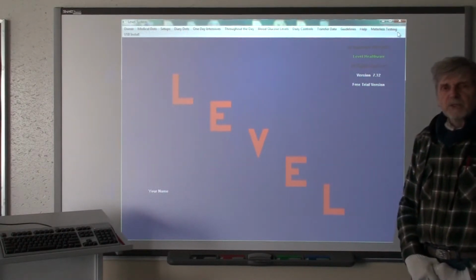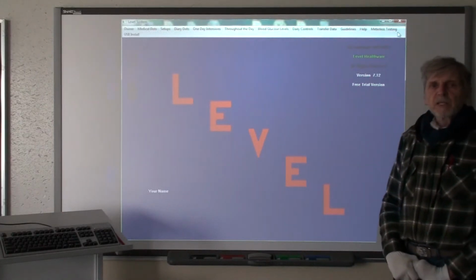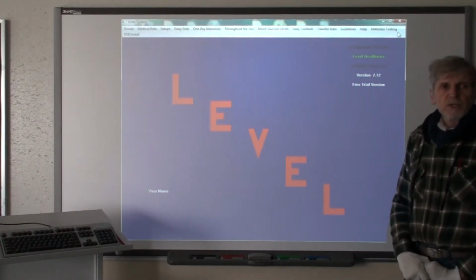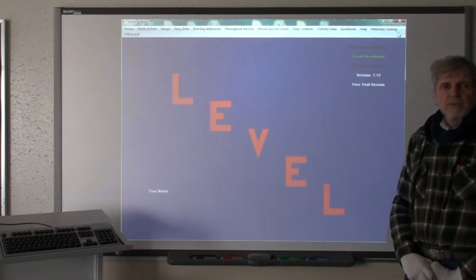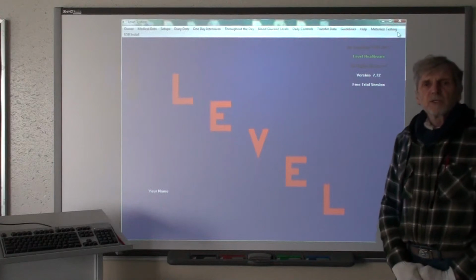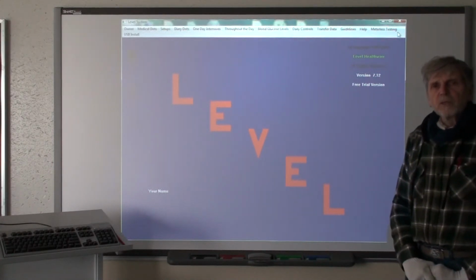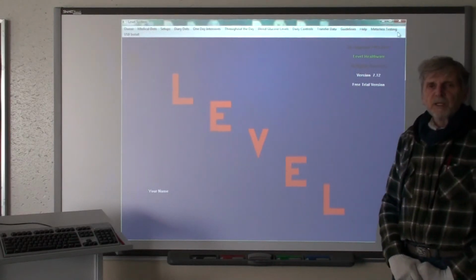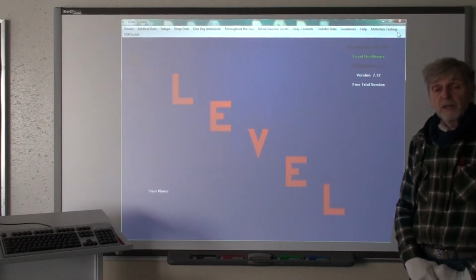If you're starting out simply yourself, then you should acquire your own website, and if later your diabetes caregiver wants to, then they can also acquire a Level product called Level for Professionals, and from that product they can see your data just as easily as you can see your data, and they can acquire one web hosting website which will service up to 200 of their patients. For now, let's assume that you're going to start by acquiring your own.